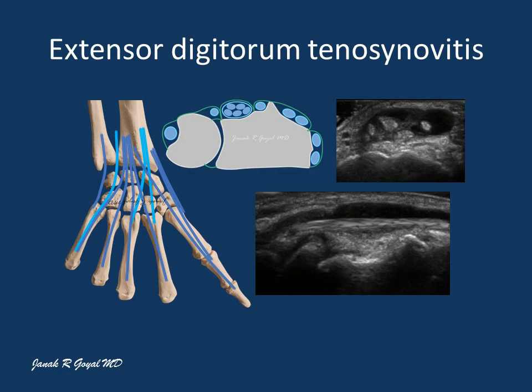This is a 38-year-old woman with undifferentiated connective tissue disease who presented with a swollen right wrist. This sonographic image shows an isolated effusion of the fourth extensor compartment of the wrist.